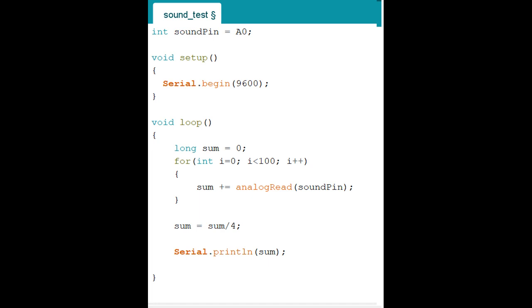And everything looks okay. You put the semicolon at the end. Semicolon means, hey, I'm done communicating with you. So let's say I'm talking to you through the walkie-talkie, and whatever I say is done, then I say over, right? So you know that my message is done.